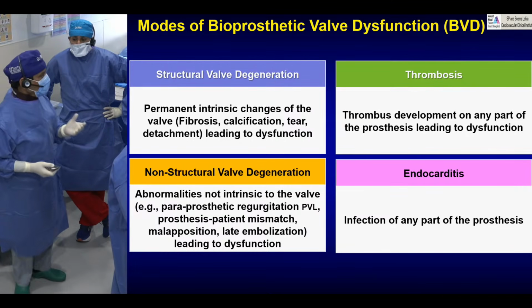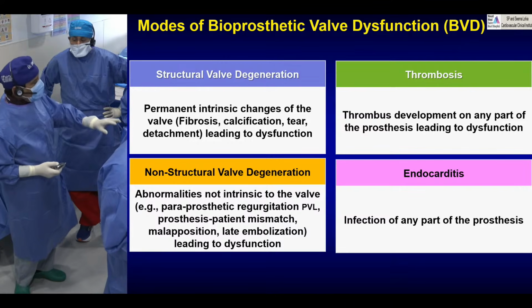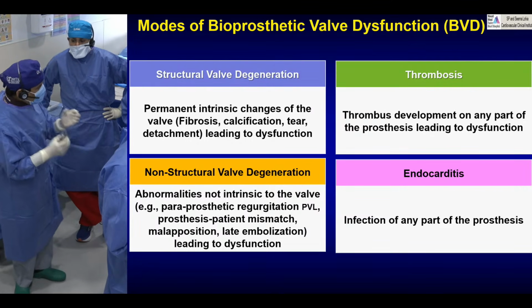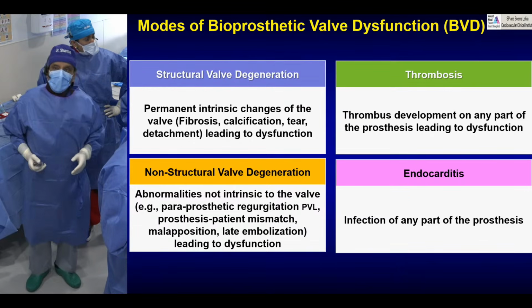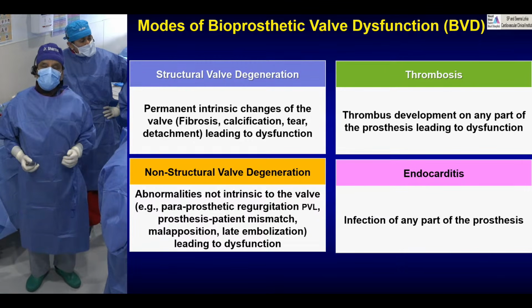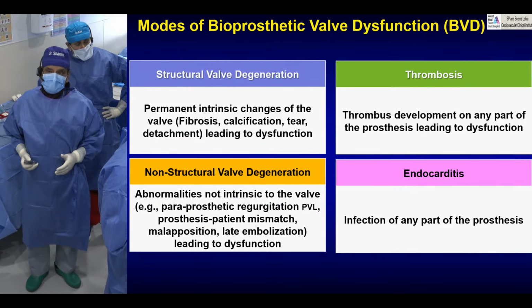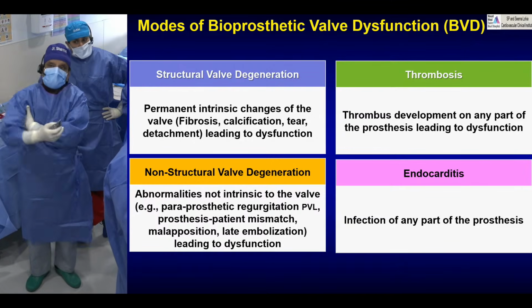I will try to look into this aspect, the recoil of the valve. There is description, but not any methodical publication on the recoil issue. No, because they don't typically do any CT scan, right? Unless there's an indication for HALT and other things. But we have now done double tap for quite some time now. We're writing up that paper, so we're showing that actually.